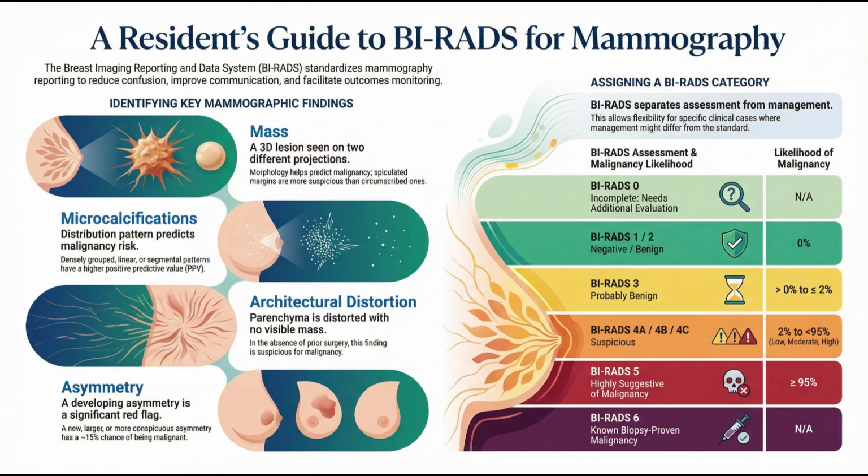Okay, so a complete mammography report is a very structured thing. It is not just a free-form summary. It has 3 mandatory components right off the bat. First, you have to state the indication for the examination. Was this a routine screening? Was the patient called back? Is there a palpable lump? That clinical context is everything.